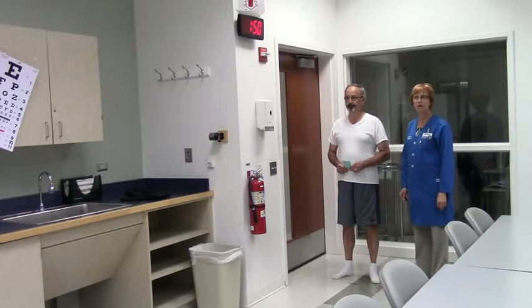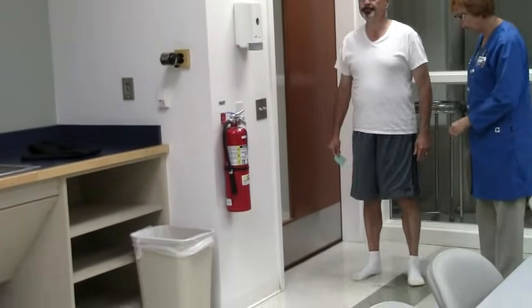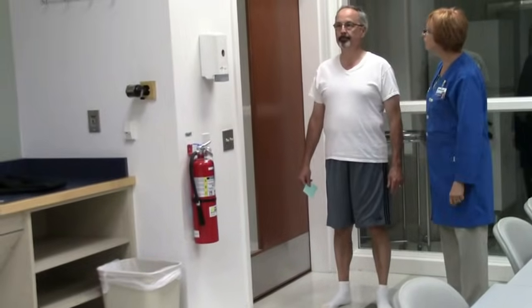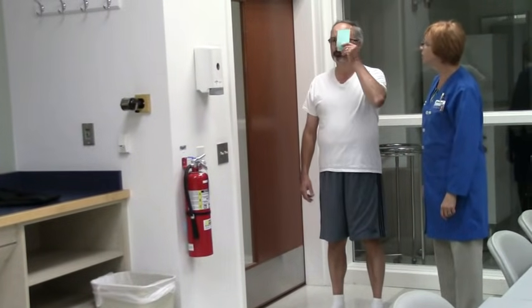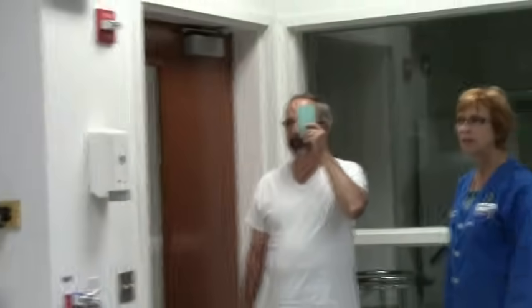So we're going to start by doing a visual acuity test. That means we're going to check your distance vision by using what's called the Snellen eye chart. So I'm going to have you step over here. Okay, so you are positioned 20 feet from the Snellen eye chart. So cover your left eye. And then on the Snellen chart, I'd like you to read the smallest line that you can read.